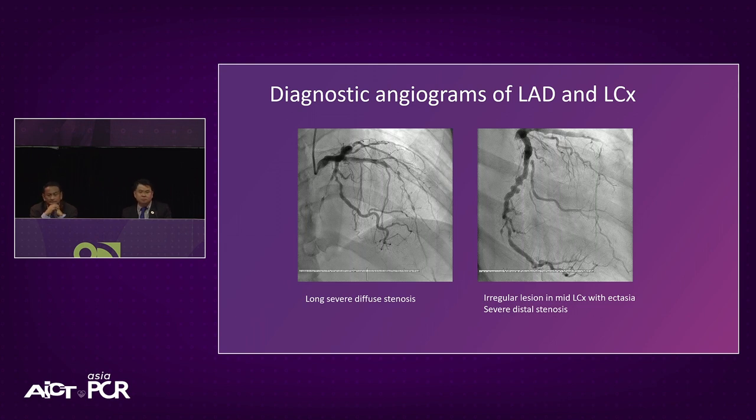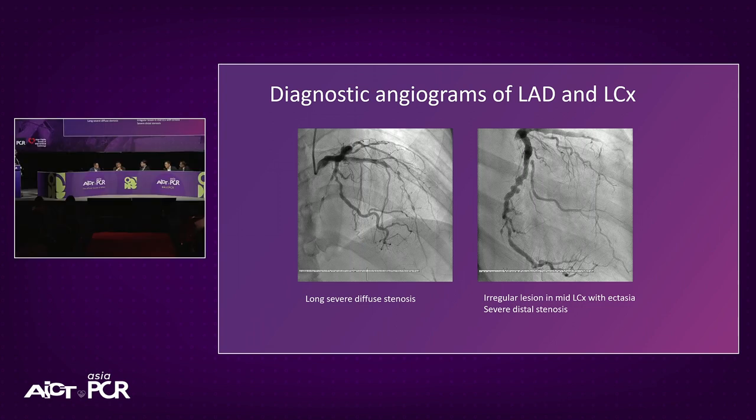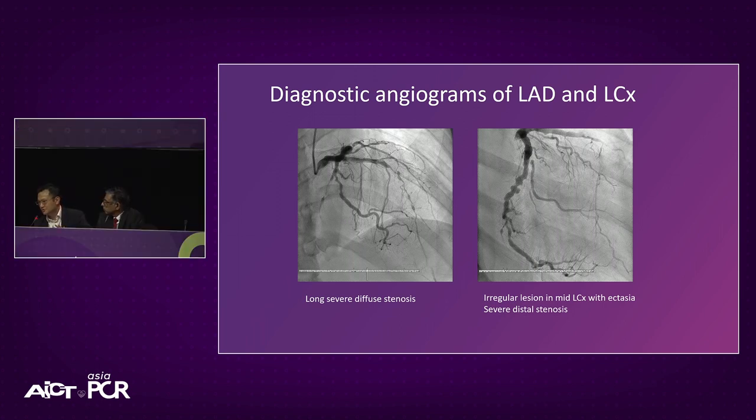Okay, I think if you're talking about the LAD, there didn't seem to be very good flow. So I think with OCT, you're probably going to struggle to see very much in this case. So for the LAD anyway, my preference would be IVUS. It's usually useful, if you can, to do IVUS before you do any ballooning. In this case, because it's subtotal occlusion or very poor distal flow, I might re-image after I balloon, because sometimes the vessel grows a little bit after you restore antegrade flow. So I would probably measure only after I restore some flow.